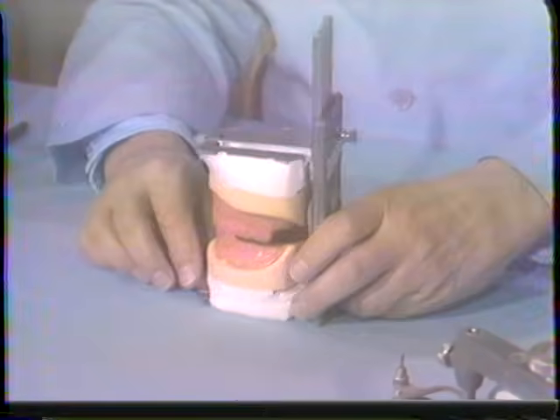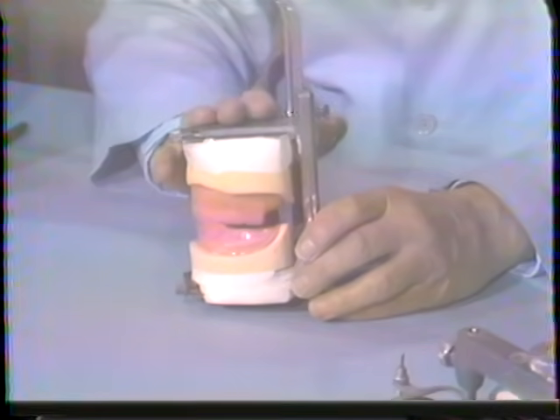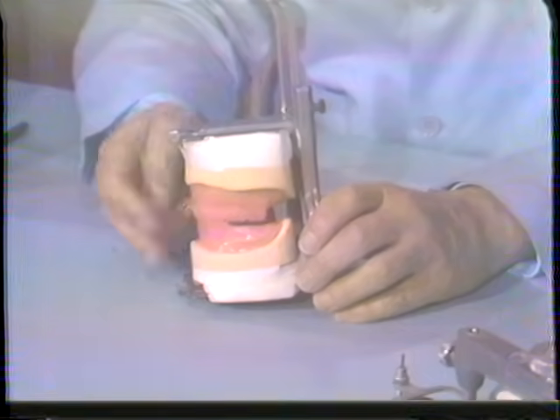All right, we made a centric relation record, and we're mounting it to this position. This we call a simple holding instrument. In other words, this instrument is capable of holding this particular recorded position, and that's about all it can do. And it moves vertically.